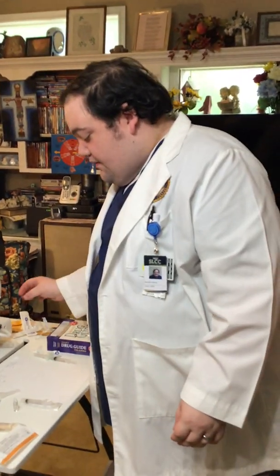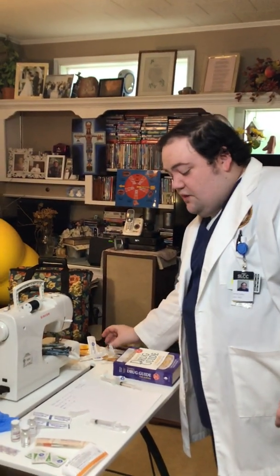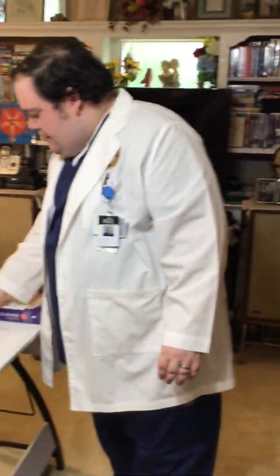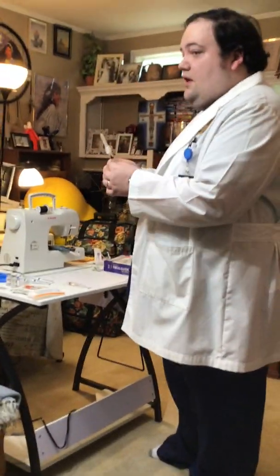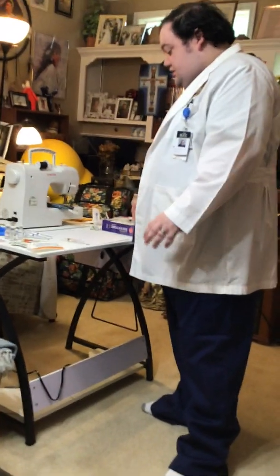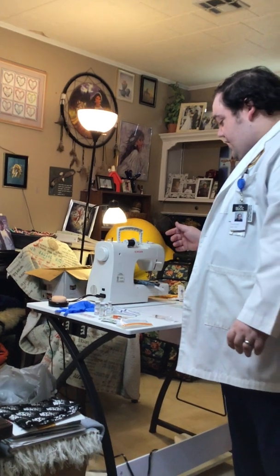I'm going to lay that down. We're going to dispose of the ampule in a sharps container because it's sharp. All right. And when you have several shots like this, you may want to label each one. That's a very good practice to label each one so we don't mix our medications up. But this is going to be our iron dextran.